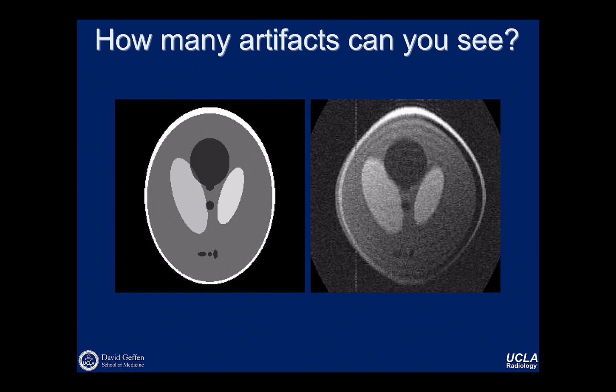Okay, and why do you say that? Right. Okay. So you're right. There is a B field inhomogeneity, but what field is it that's causing it? What if I said it might be a different field? No, you're totally picking up on it in terms of seeing the artifact, right? And so I want to see if I can sort of tease it out, right? So related to that artifact was this other thing that we see, right? So you called it bow-leggedness. Absolutely, it has this kind of bent look to it. There's also no imaging data sort of in the corners there, right? What causes that? You had a homework problem that was partly related to it.